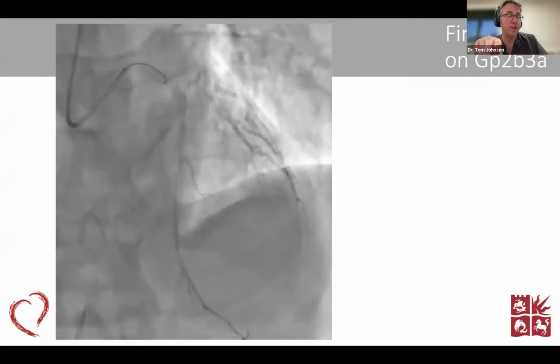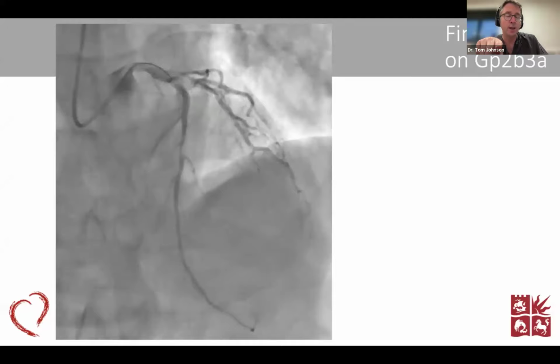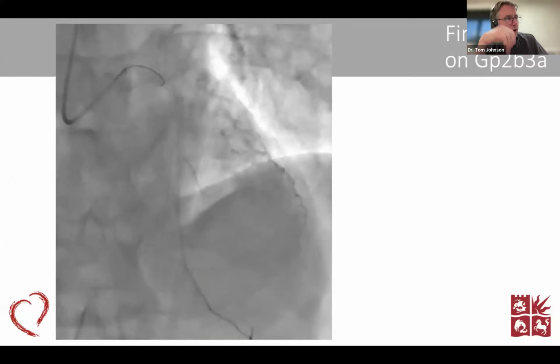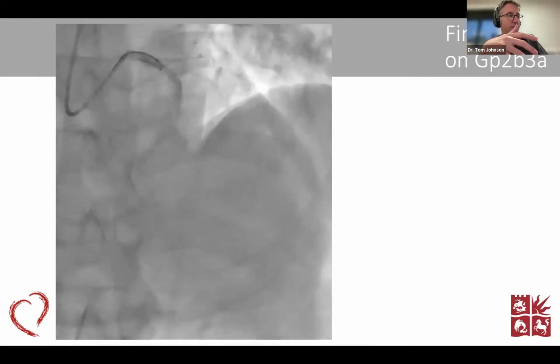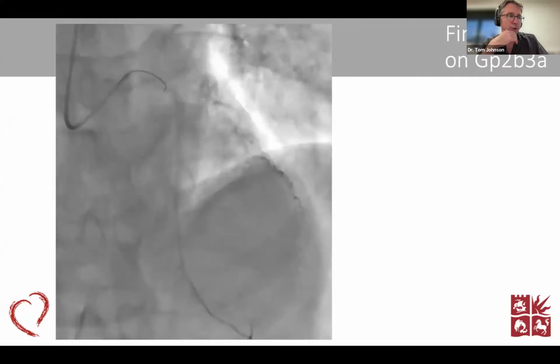I have to say, for me, this was really quite marked thrombus protrusion. And a lot of my colleagues would actually bring this patient back as an inpatient. And I don't see a huge advantage in bringing patients back early, because I think it's very likely you're going to continue to see defects. So the timing of bringing someone back, I think, is quite important.